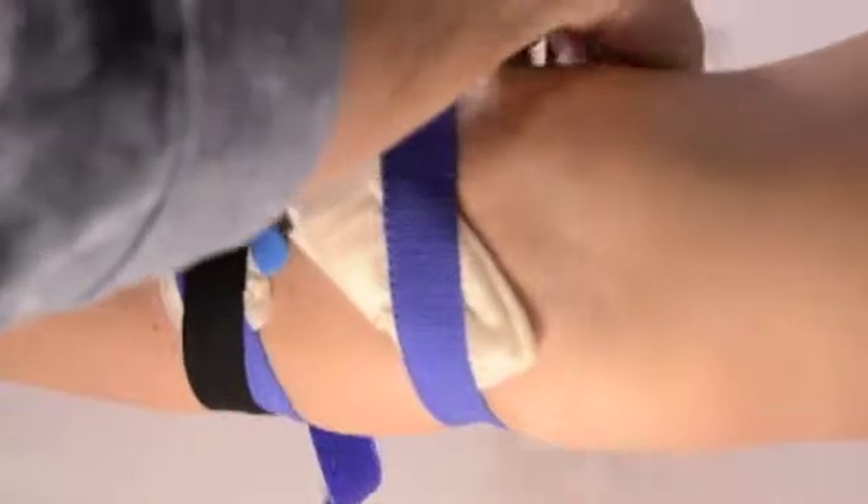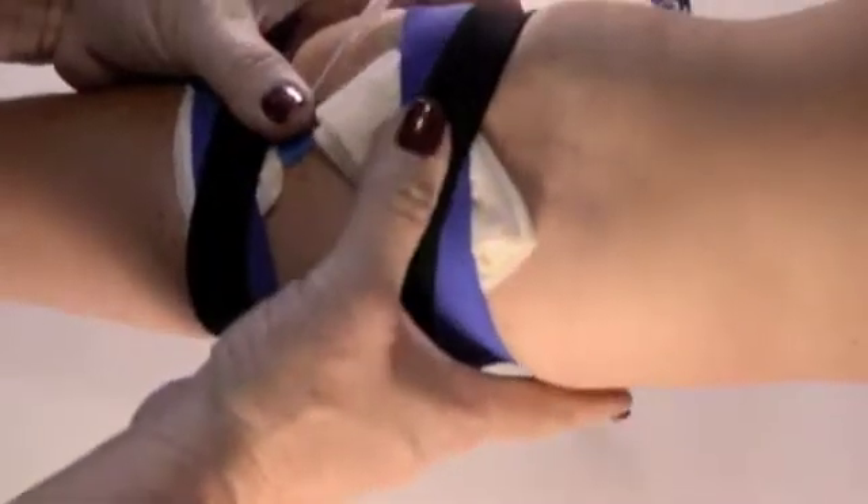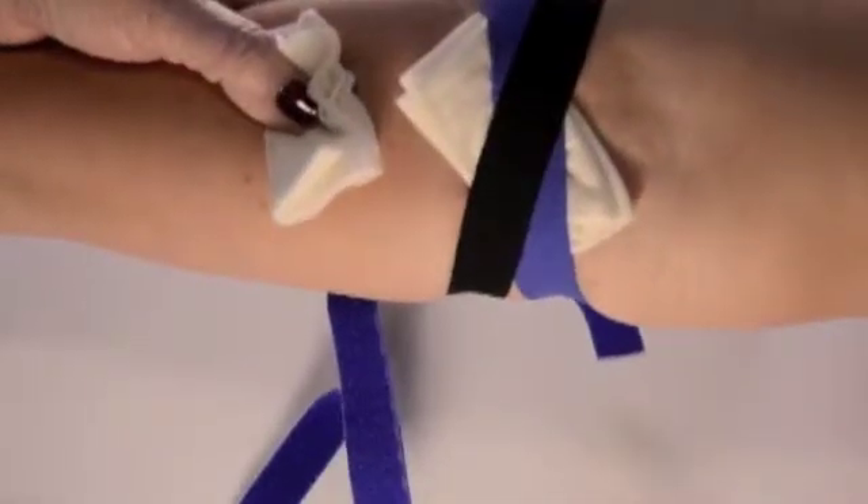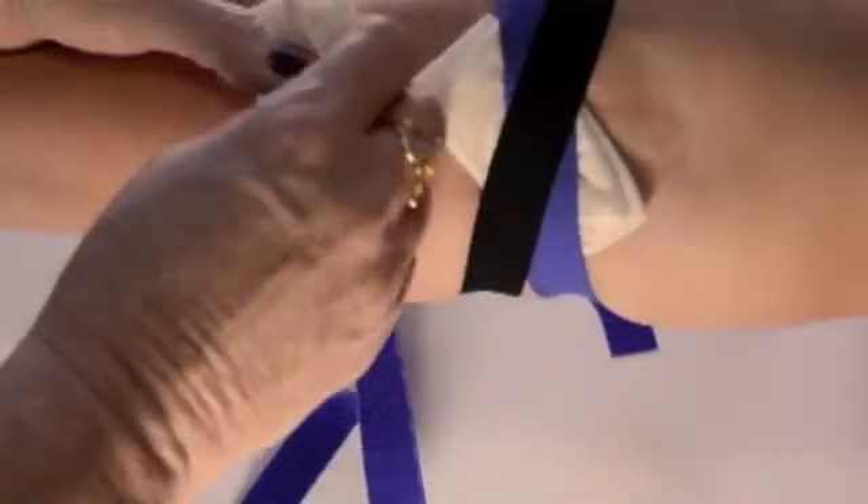Continue with the black strap, crossing the gauze and increasing the pressure over the site. Repeat this step for the bottom needle. The patient may wear the needle nurse home and remove it when they are comfortable.